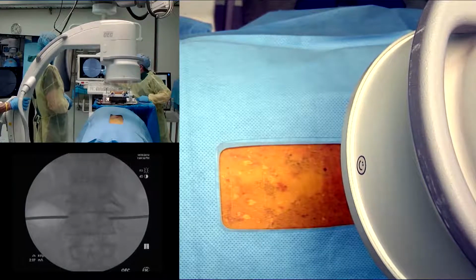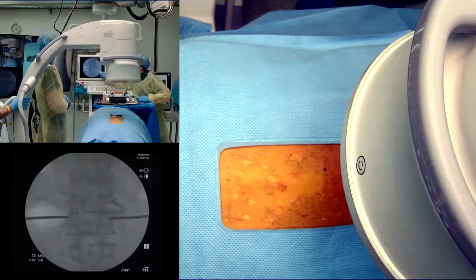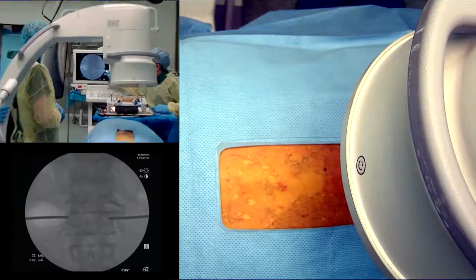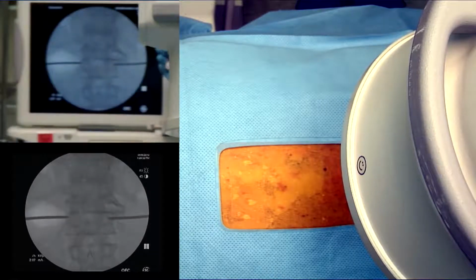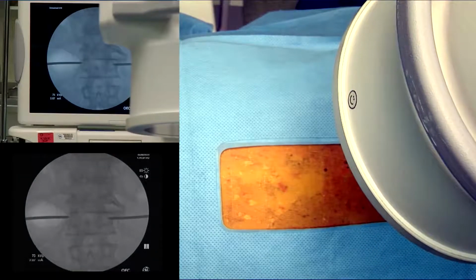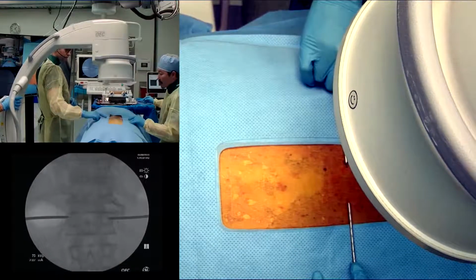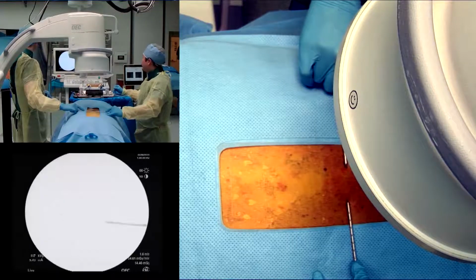And we're going to try to converge together. So if you take a look at this quadrant, I'm going to try to stay in my half, and then Zane's going to try to stay within his half. And then on the sagittal view, we're going to try to be in the center, but slightly a little bit anterior, okay? So we're going to start by putting our Jamshidis here, and go ahead and picture that.